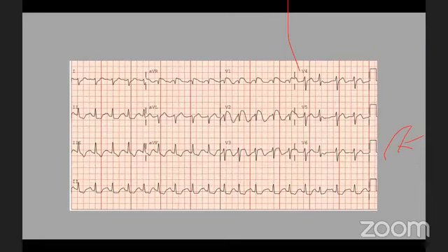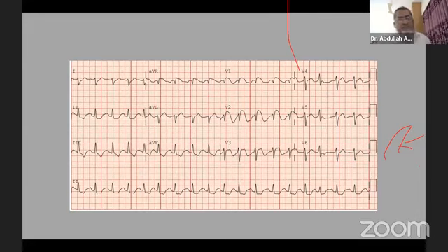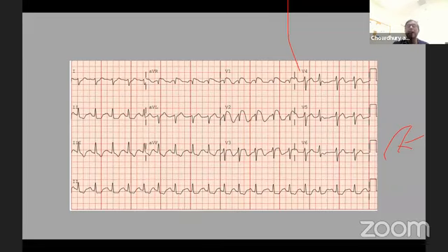No, sir. Because the ST changes do not fit any particular type of MI, and the clinical context also doesn't fit MI activation. Correct. Any comment on the morphology of the ST elevation? Down-sloping shoulder. Yes, these are usually not STEMI, right? And echo was done: hyperdynamic LV. The patient came in with tricyclic antidepressant overdose.